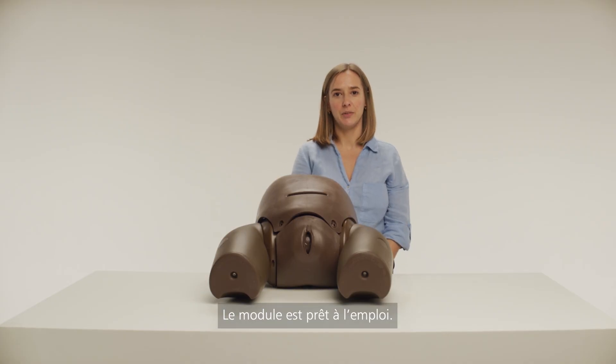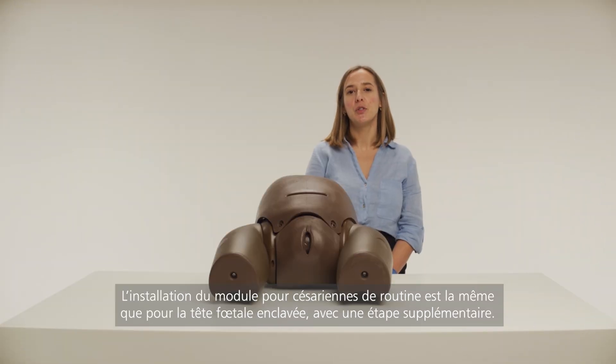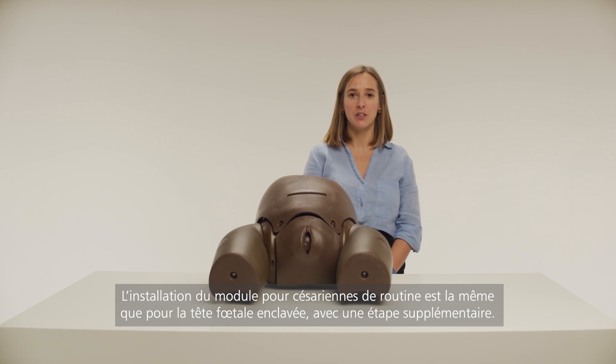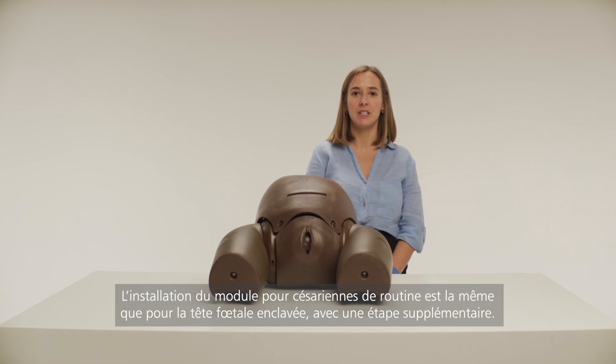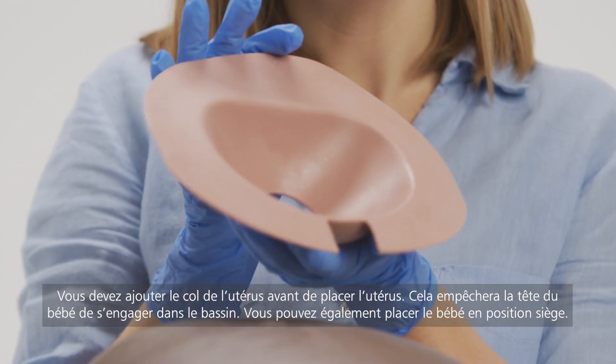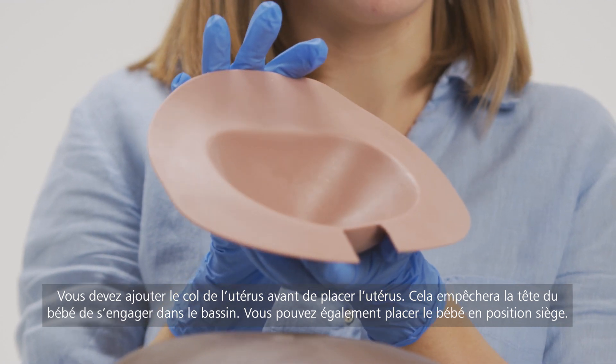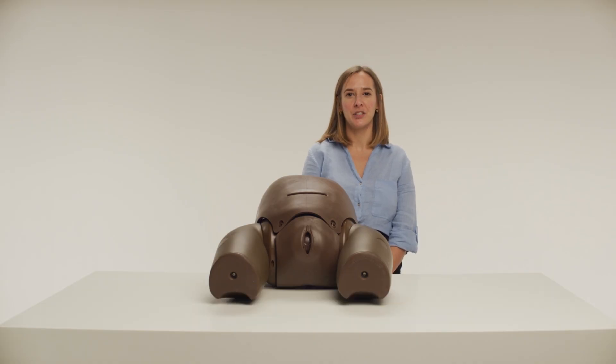The module is now ready to use. Setting up the module for routine caesarean sections is the same as for impacted fetal head training, but with one additional step. You need to add the cervix prior to adding the uterus. This will prevent the baby's head impacting into the pelvis. You can also load the baby into the breech position.